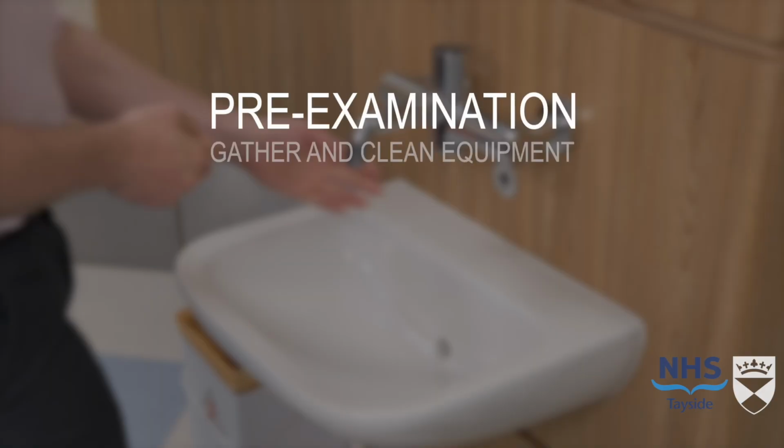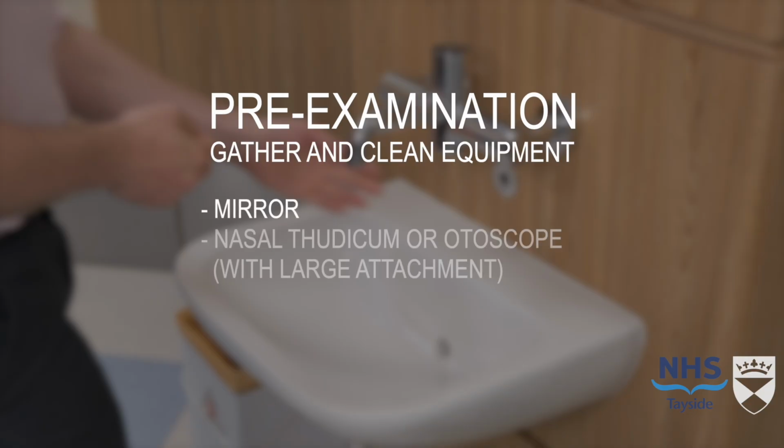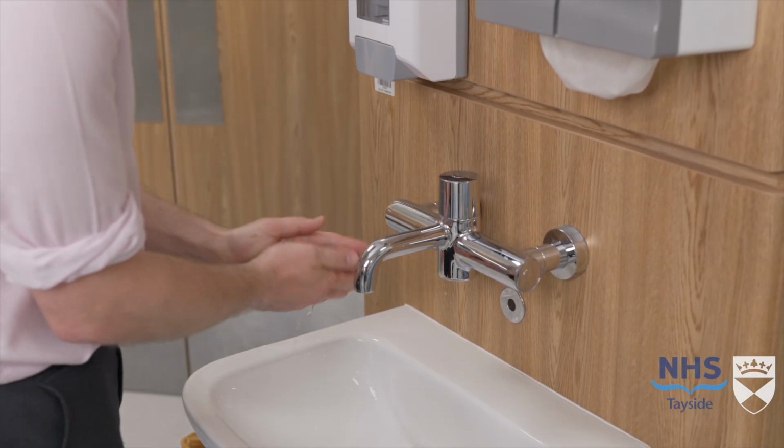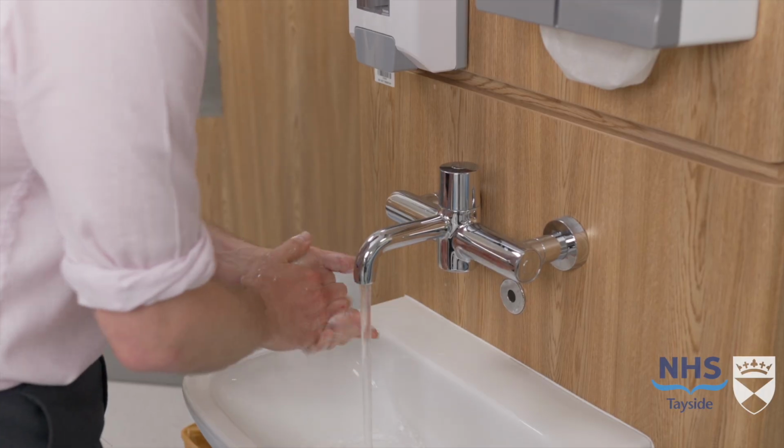Gather and clean required examination equipment. You will need a mirror and a nasal Thudichum speculum or an otoscope with a large attachment. Ensure appropriate infection control by decontaminating your hands.